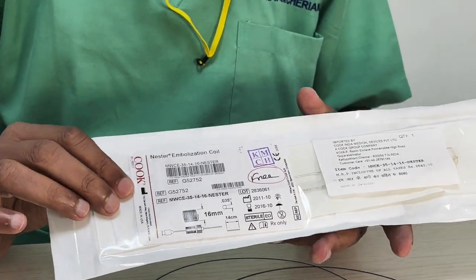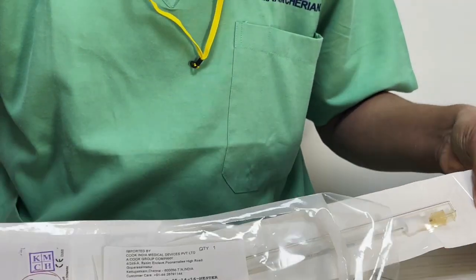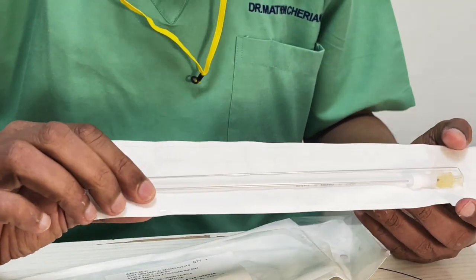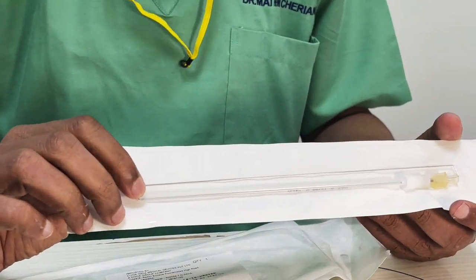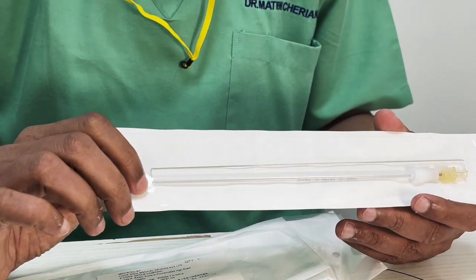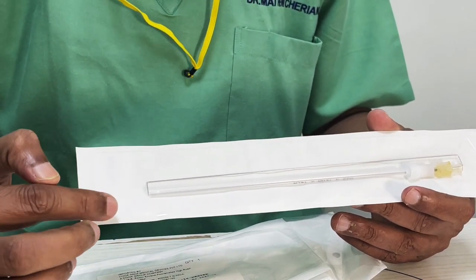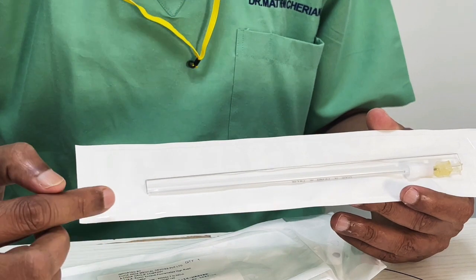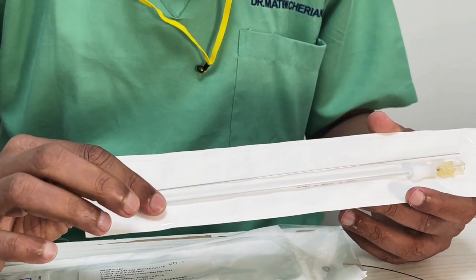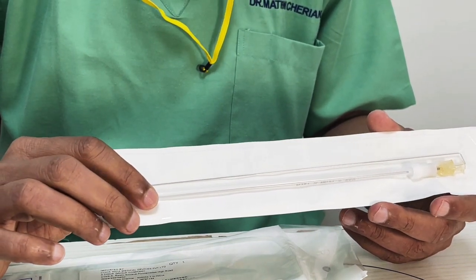So how are these coils made? I'll just quickly show you a coil. This coil is technically made of platinum. And why do they make it with platinum? Purely because platinum is radio-opaque. Otherwise you can even use stainless steel. It works exactly the same way. The only difference is stainless steel is not very radio-opaque, and you need radio-opacity to be sure where you're going. To make these thrombogenic, you will also have to put a thrombogenic mesh on it, and the commonest thrombogenic mesh they use is a material called Dacron. So they put Dacron fibers onto it, right?